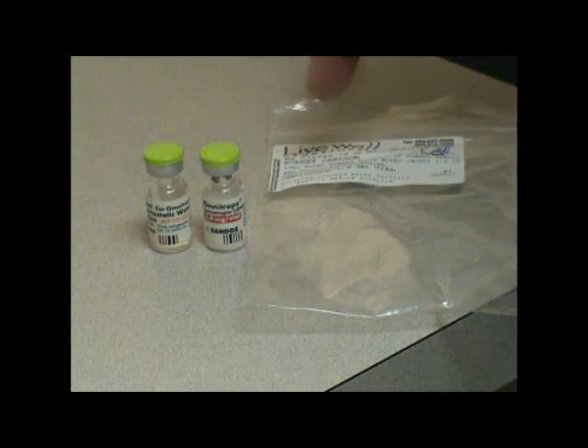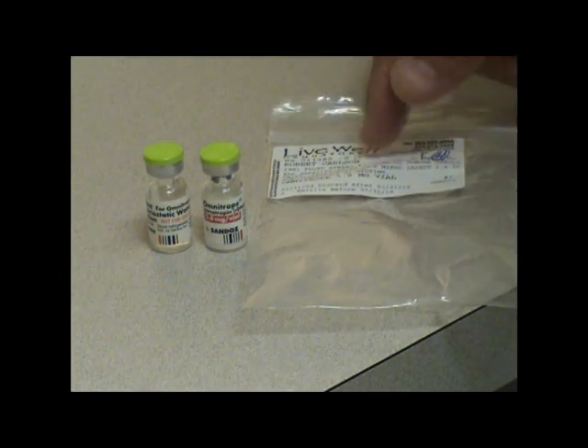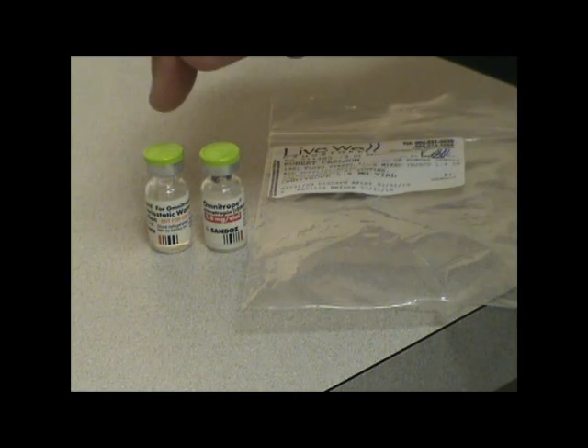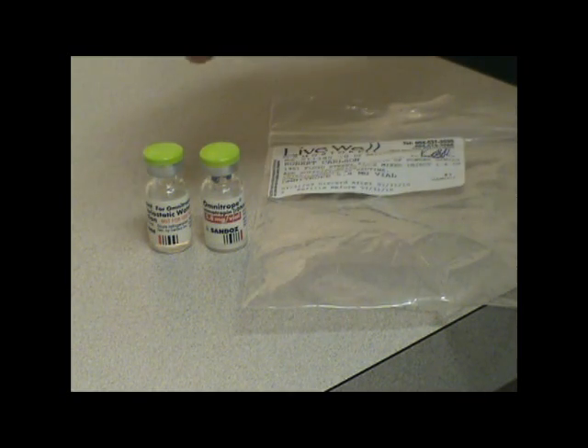These are the two vials that you will get for the Omnitrope, or the growth hormone. They come packaged together — one is the powder, one is the water. If you receive more than one package, then you'll receive four, but in this instance there's one powder and one water.